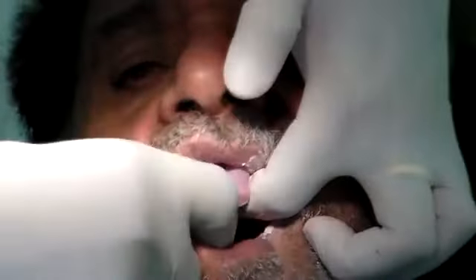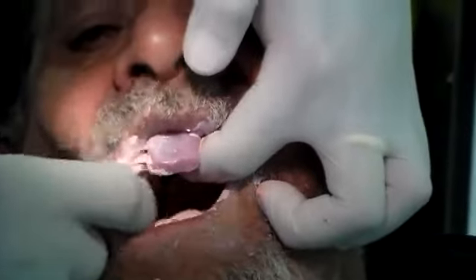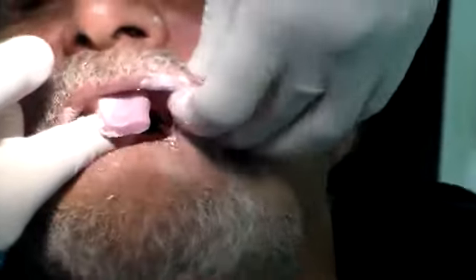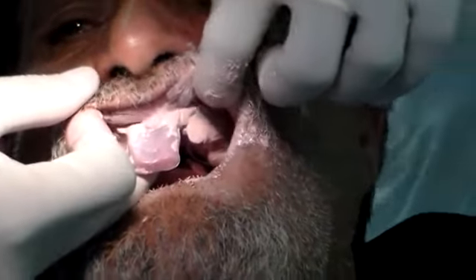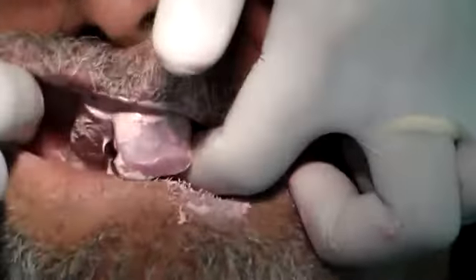Have a look — still soft. When you're doing the molding, you want to look inside the mouth to make sure you can see the green stick. Can you see the green stick here? You want to make sure you see the green stick because your borders should be at the level of the green stick and not beyond it.